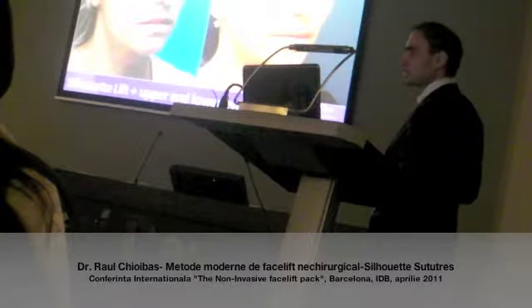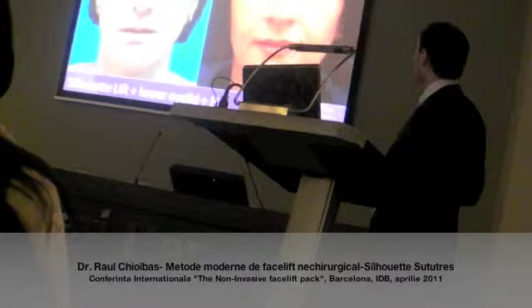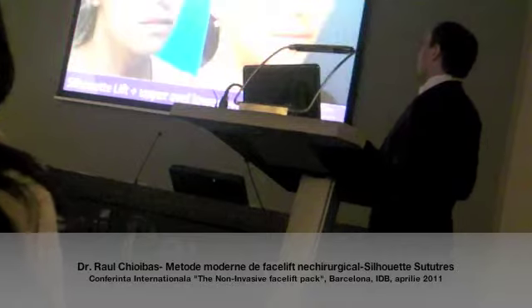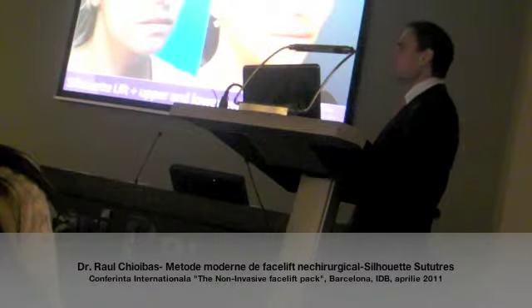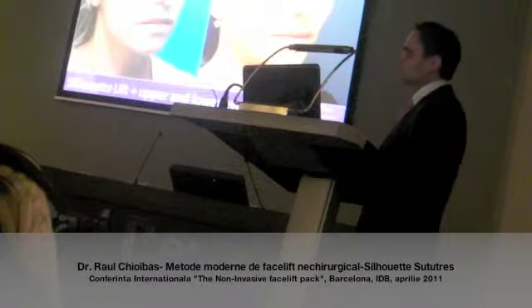And hyaluronic acid again, just in the malar area. How much? Well, to be honest, I couldn't tell you exactly, but around 1 mil. We usually don't go more than 1 milliliter.